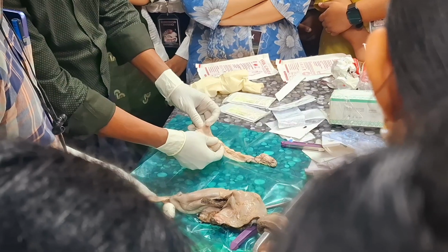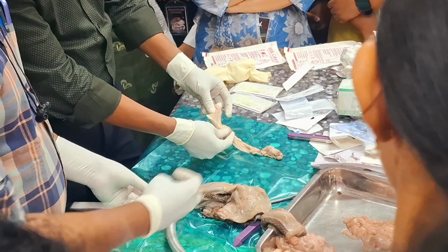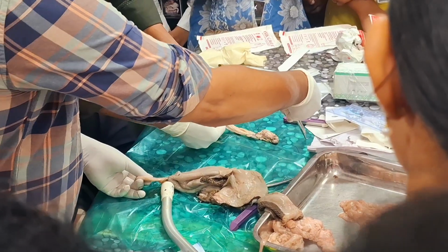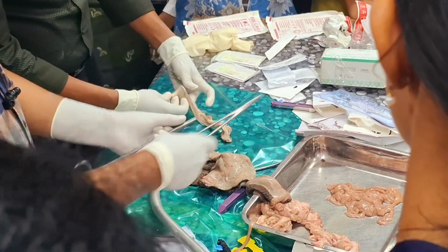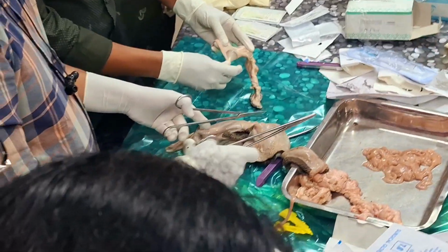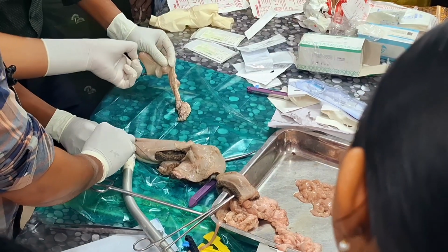And use the sharp edge here. Here is the lower part. You can bring that like this. Okay, sorry, we are doing it again.